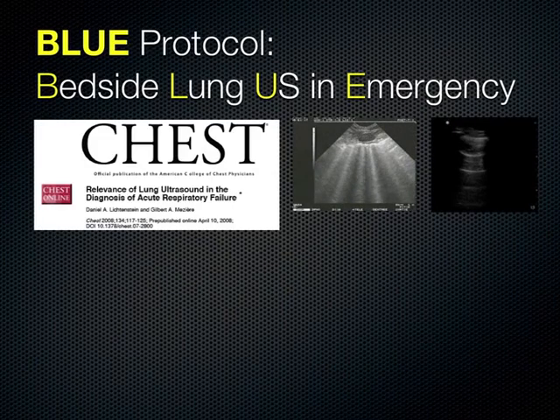Daniel Lichtenstein of France is one of the key fathers of pulmonary ultrasound in critical care. He developed the BLUE protocol to diagnose causes of acute respiratory failure. He did this by taking patients with a diagnosis of acute respiratory failure and scanning their chest, alongside the usual diagnostic tests, including chest x-rays and CTs. What he found was that he recognized certain patterns of artifact of A lines and B lines and sliding and so forth that correlated with the ultimate clinical and radiological diagnoses.